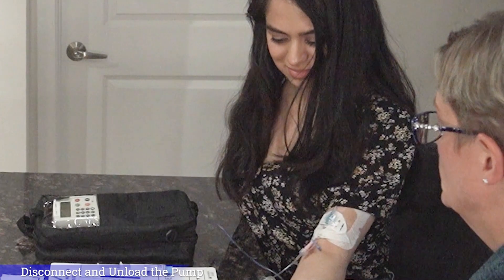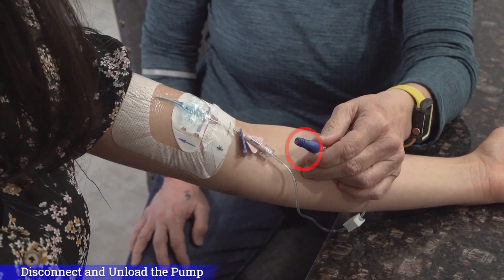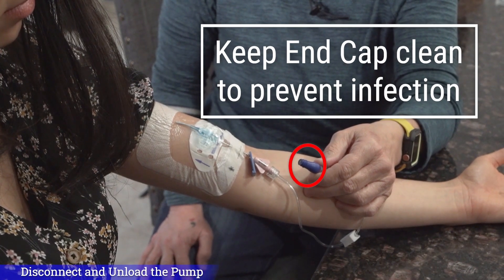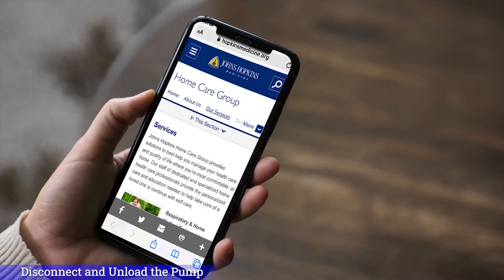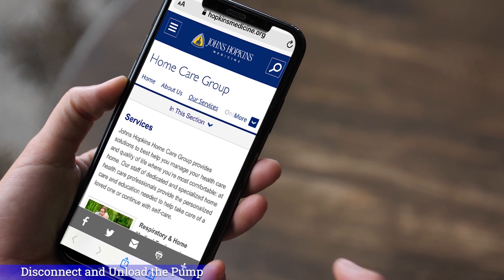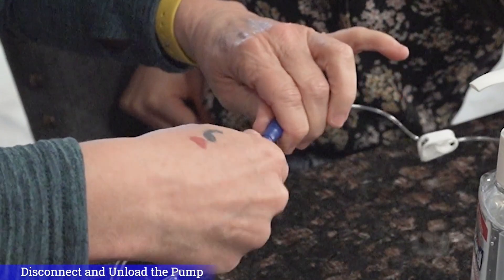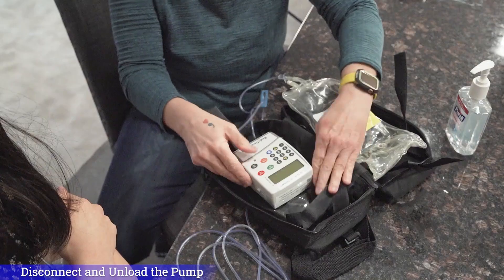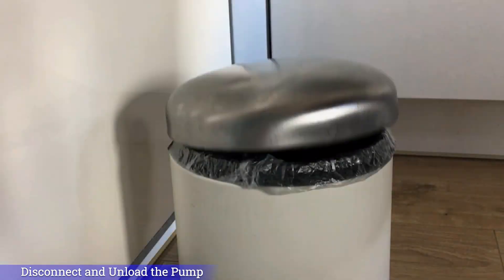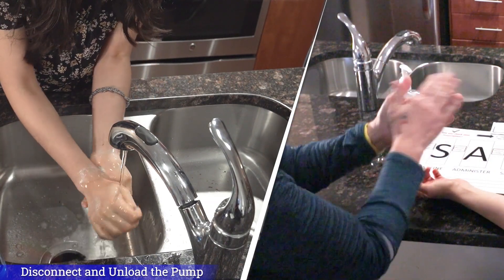Now we will disconnect the medication tubing from your IV line. Make sure that you do not remove the end cap on your IV line. The end cap protects your IV line from bacteria. It is very important to keep the end cap clean to prevent infection. The one shown here is blue, but your end cap could be another color depending on your home infusion provider. You can ask your nurse what color your end cap is. Remember, it is very important to keep it clean. To disconnect the medication tubing from your IV line, grasp the end cap with one hand, and with the other, unscrew the medication tubing until it's disconnected. Remove the medication tubing and the bag from the pump by lifting the latch to open the pump door. Lift the tubing from the pump and discard in normal trash. Now wash or sanitize your hands. Remember to wash or rub for a full 20 seconds.